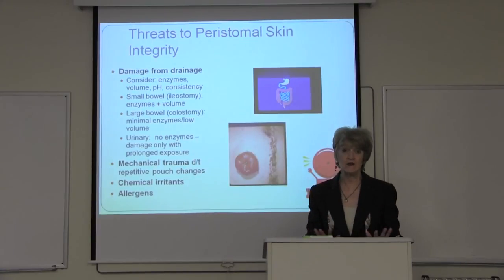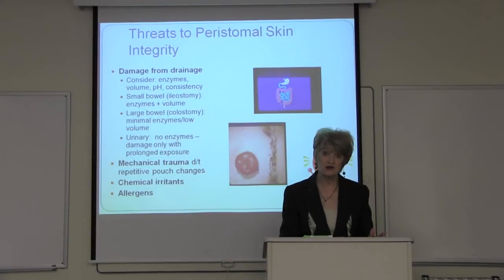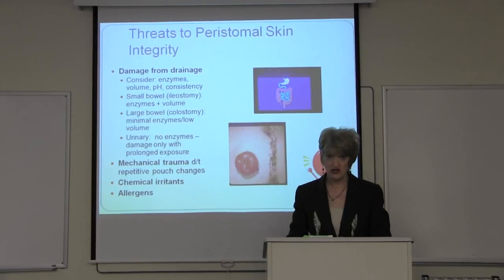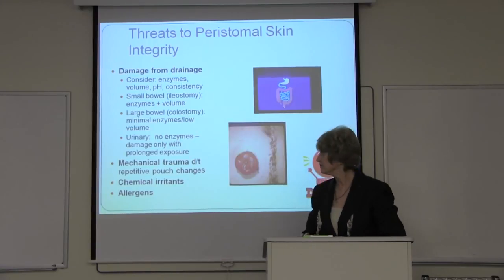And finally, any product we use can cause an allergic reaction. All of the products are labeled hypoallergenic, meaning that the companies have worked hard to minimize the risk of an allergic reaction, but there's no such thing as a product to which no one will react. So we have to watch our patients and be aware that yes, they could develop an allergy to one of the protective products we're using.